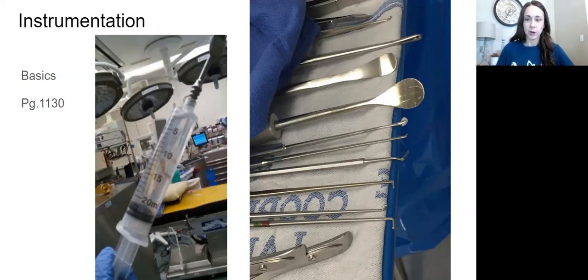So you're gonna wanna have lots of different sizes, and think about the first thing we're doing. We are drilling and then sucking up all that bone and irrigation that's happening during that time. So that suction is gonna get clogged very quickly. So you need to always have more suctions available because I'm not gonna let my surgeon wait on suction, because typically in surgery, they'll say, oh, my suction's clogged. They'll hand it to you. You need to deal with it within 30 seconds.